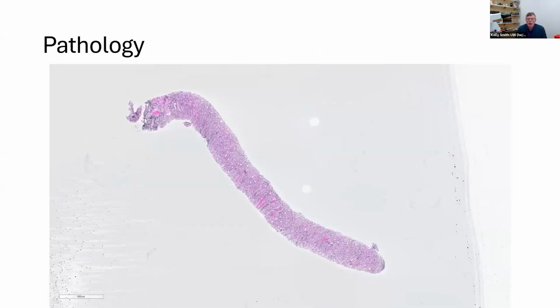Okay, so we'll move on to the biopsy, and here's a low power view, and just ask everyone to circle the area that's renal cortex in this biopsy.